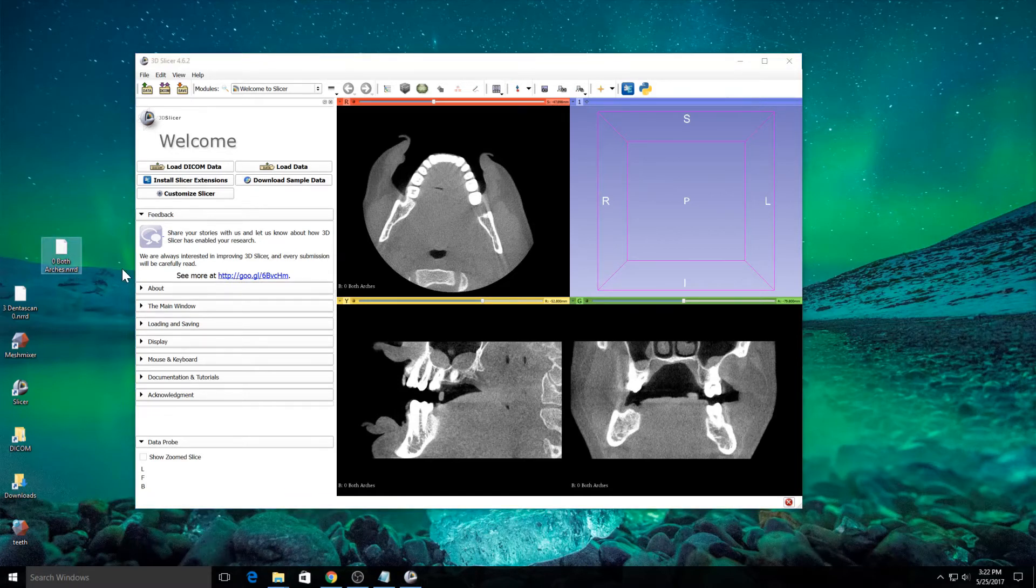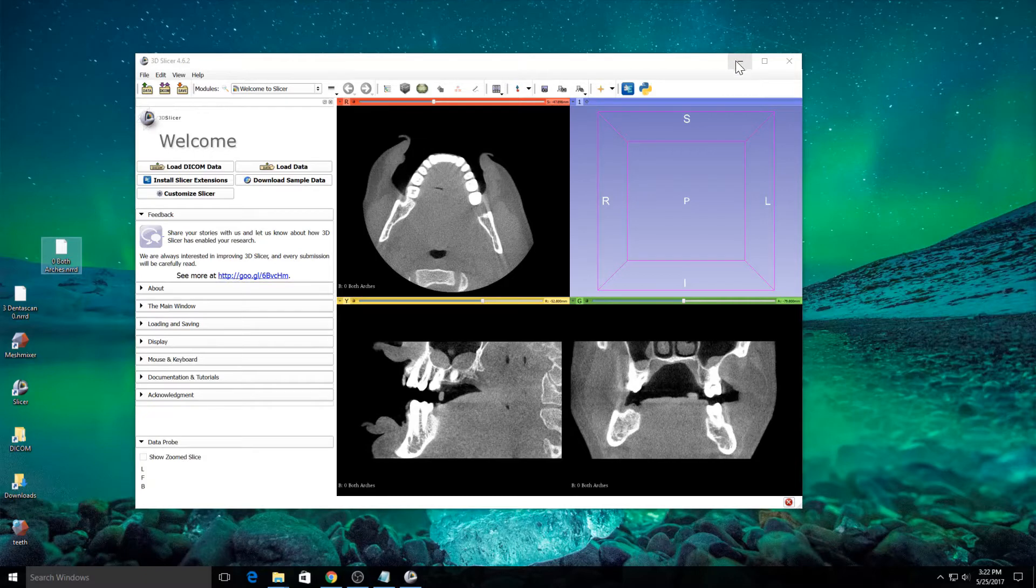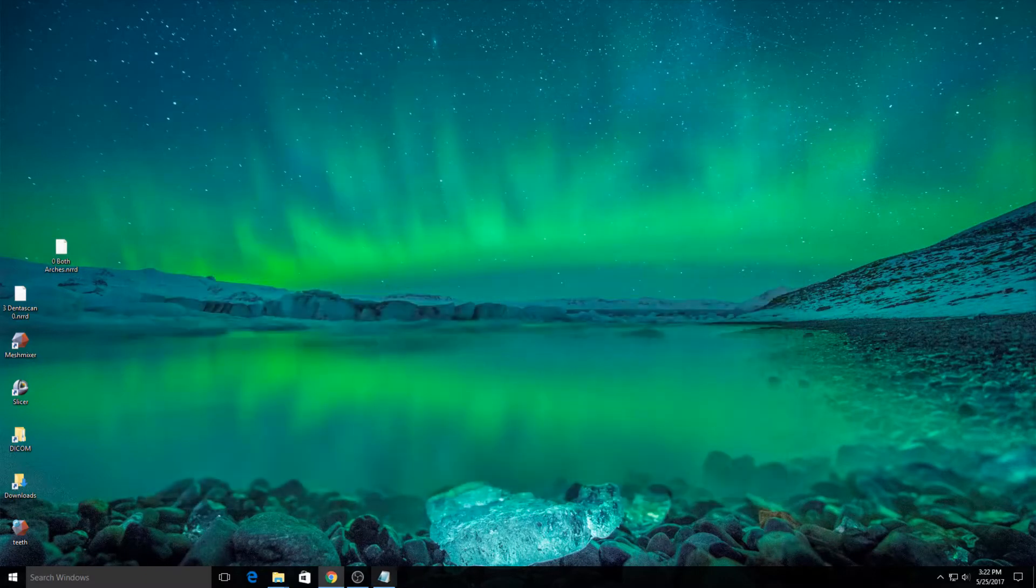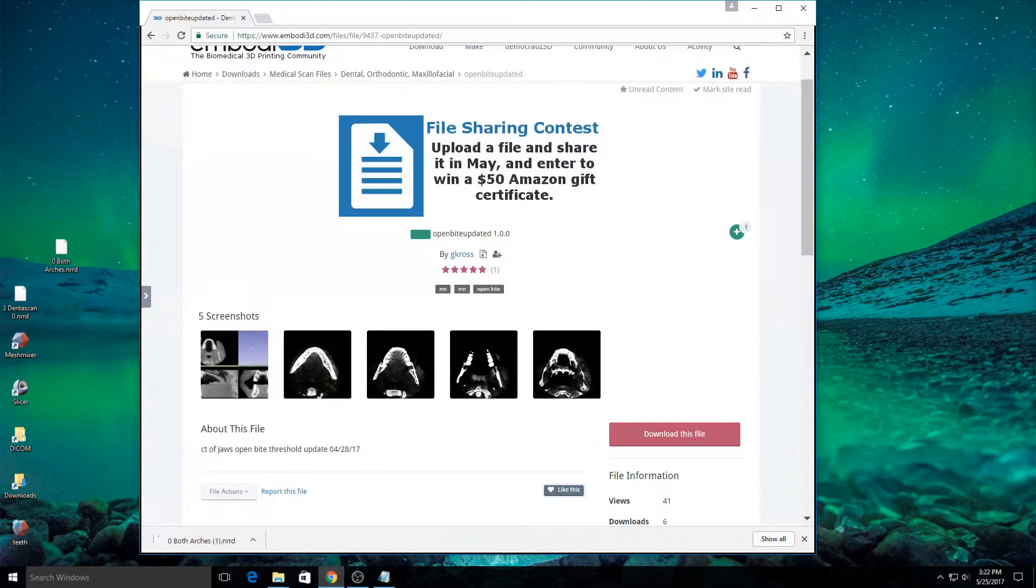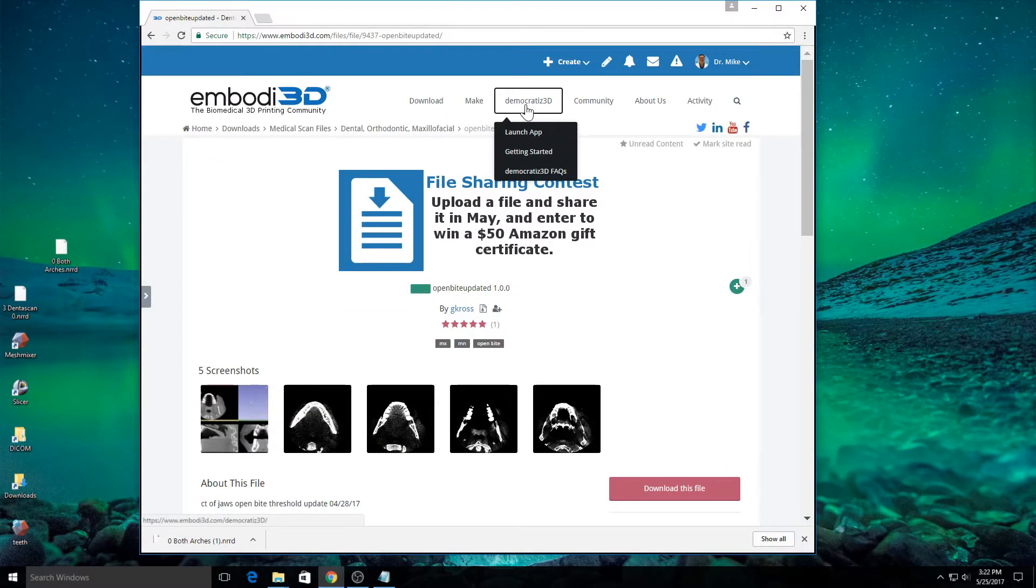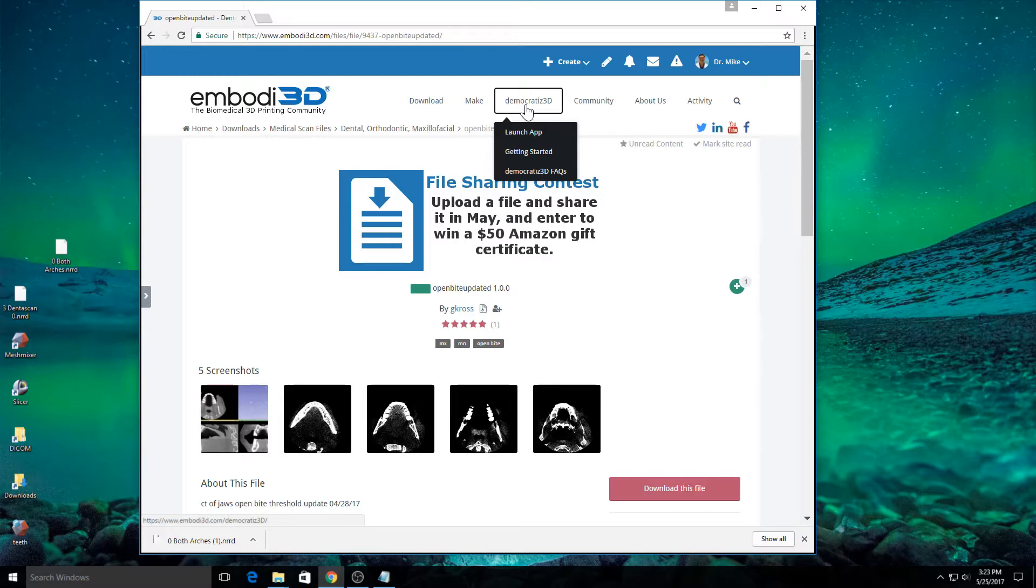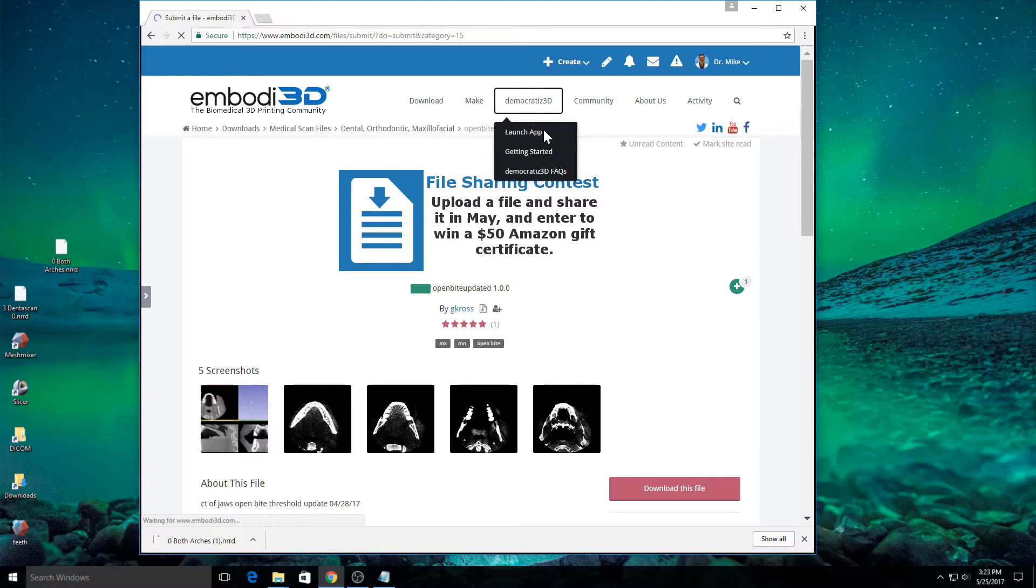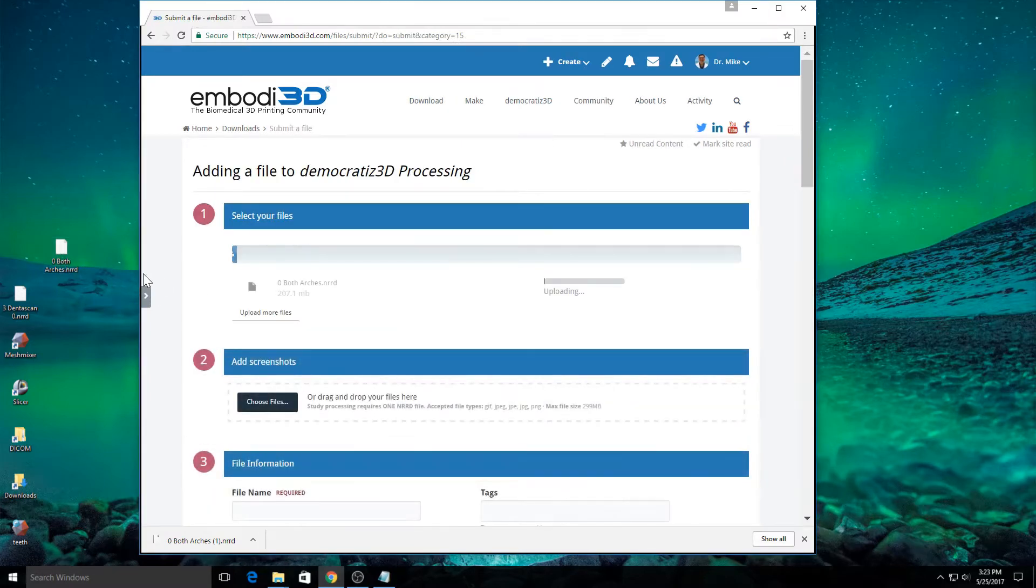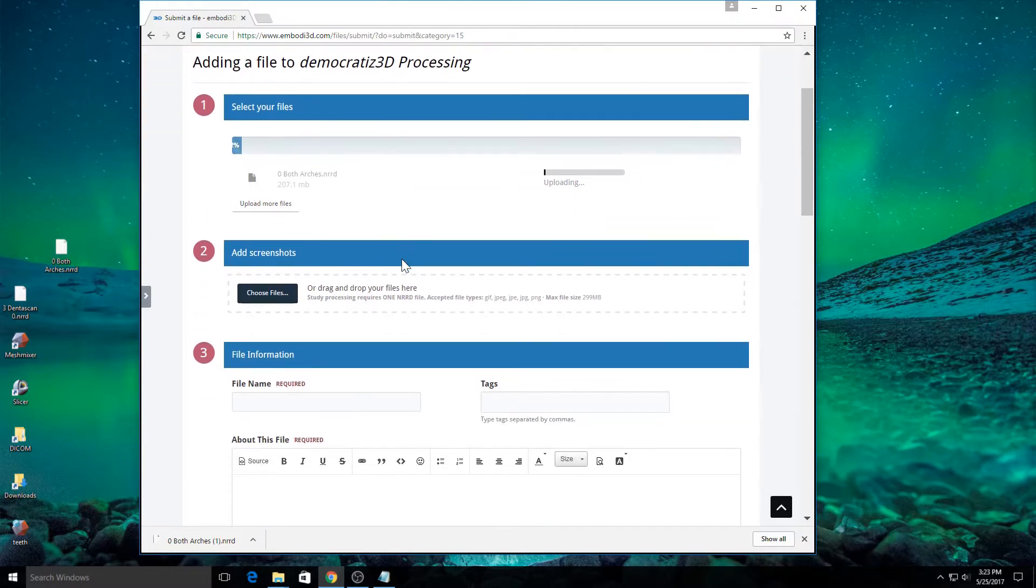Now, this is already in the NRRD format. That's what the Embodi3D website takes. I'm going to go ahead and close that out and go back to the Embodi3D website and go to Democratize, which is the free online file conversion service that will convert a CT scan into a 3D printable model. I'm going to go to Democratize and click Launch App and drag and drop my both arches.nrrd file onto the application and it will begin to upload.